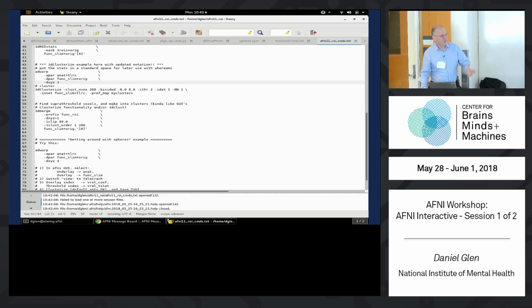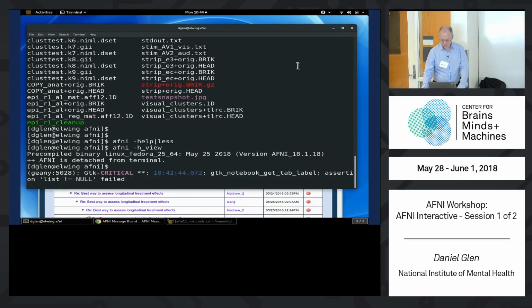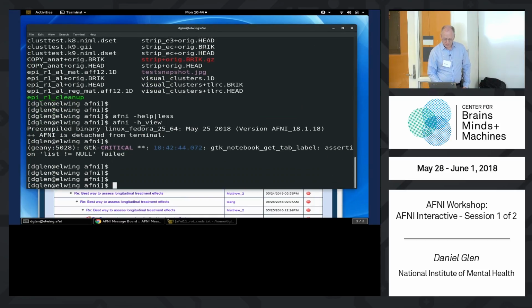The reason we stuck with T-shell is mostly because it's a simpler syntax to read for people that don't want to master the shell programming thing. So we stuck with it for that, even though Bash is more powerful. But again, most of you in here are probably using Bash, and that's fine. But our scripts are more often written in T-shell.